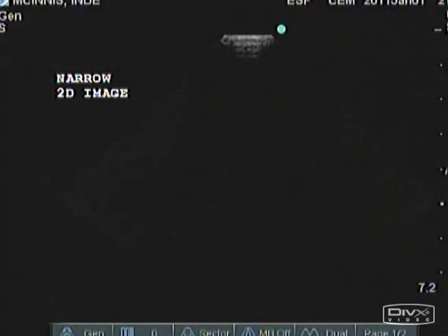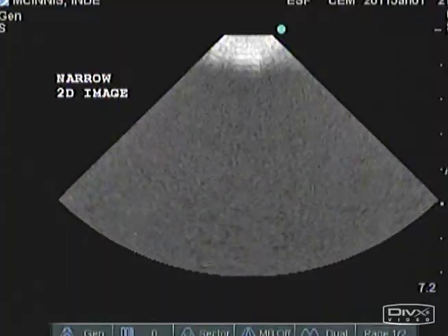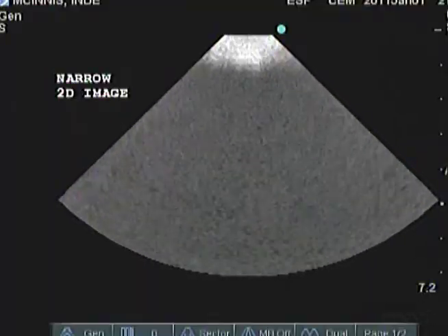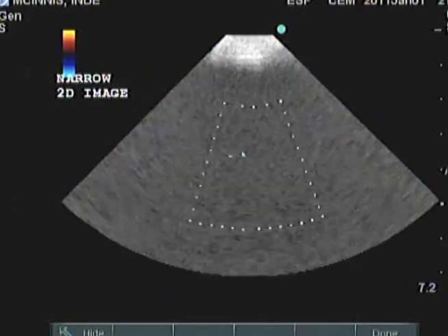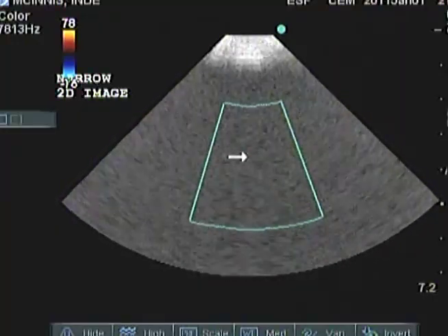Color Flow Doppler requires a tremendous amount of computer capacity. Maintaining a two-dimensional cardiac image also requires a tremendous amount of computer capacity. The area of color flow interest should be centered on the ultrasound screen. Therefore, we really do not need to look at the entire two-dimensional image.